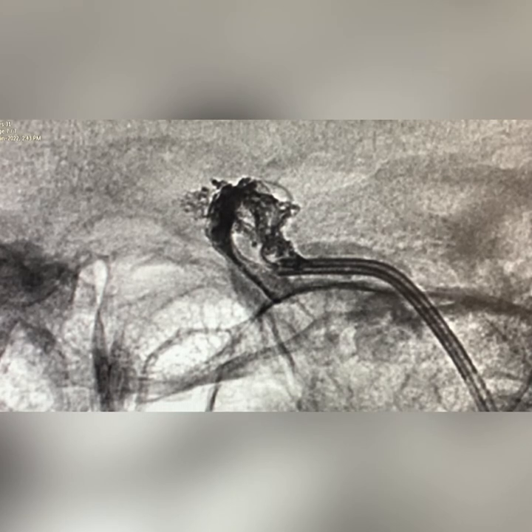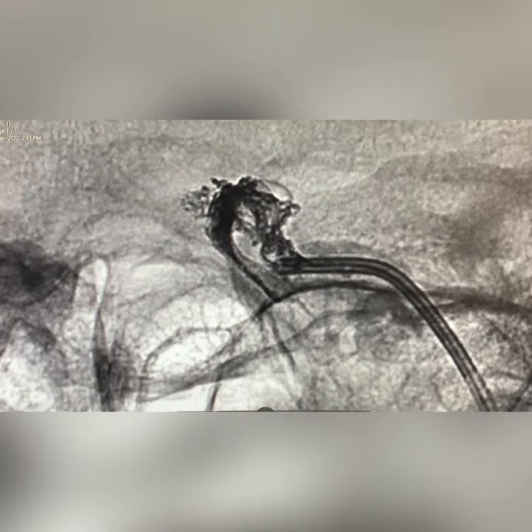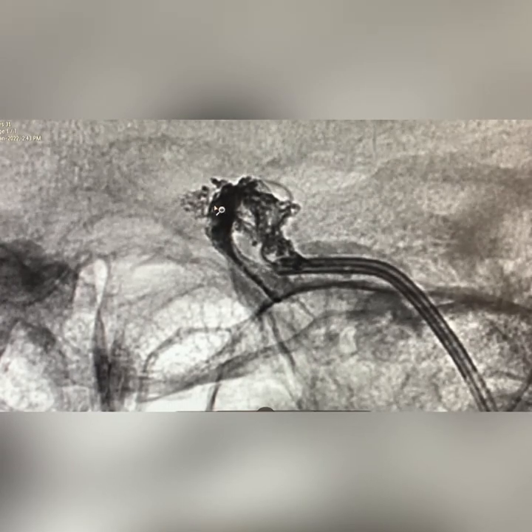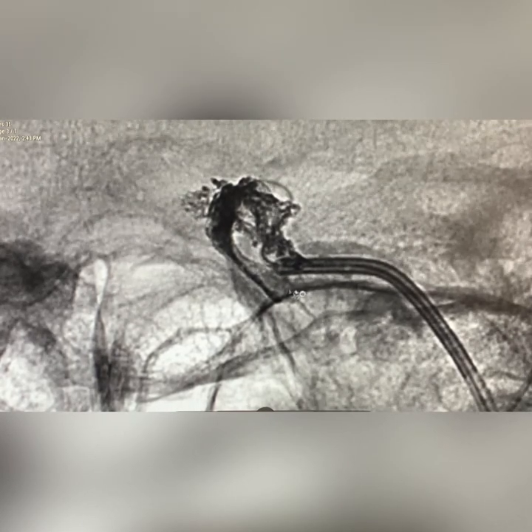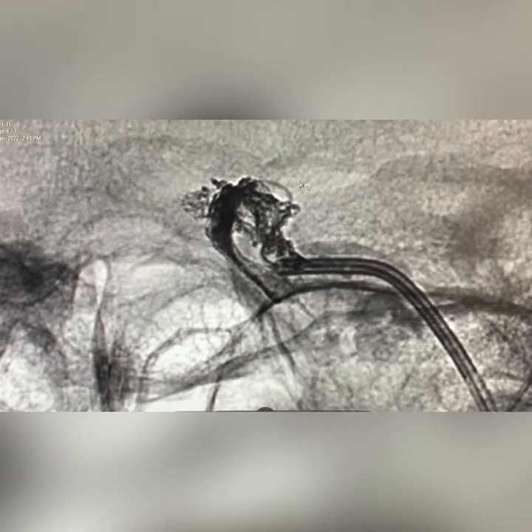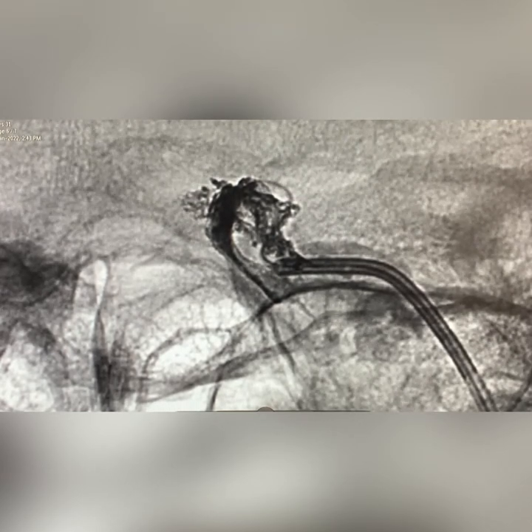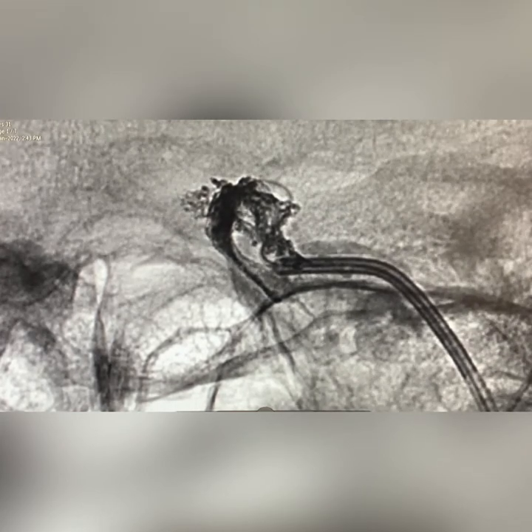We are now embolizing the left side of the cavernous sinus with Onyx, hoping for a little more penetration so that some Onyx might pass through the inter-cavernous connection to the other side — but that didn't happen. So we will complete embolization of the left portion of the cavernous sinus, then reposition and approach the right side to deploy coils and Onyx together, or whichever material is most suitable.